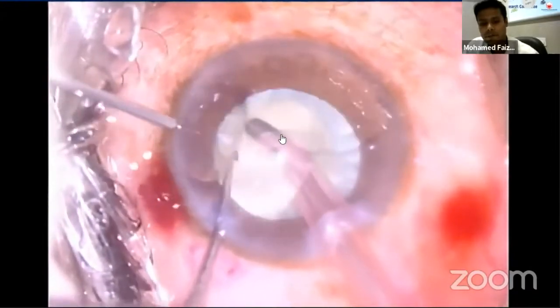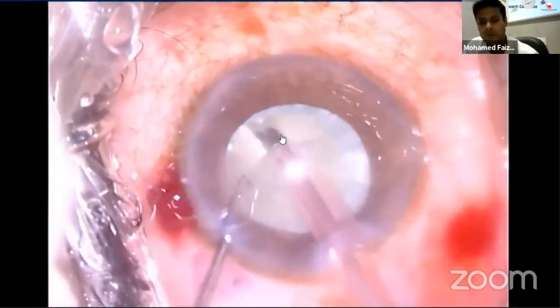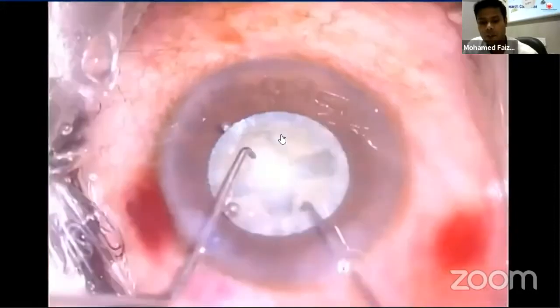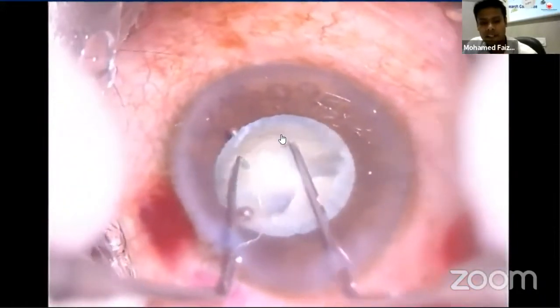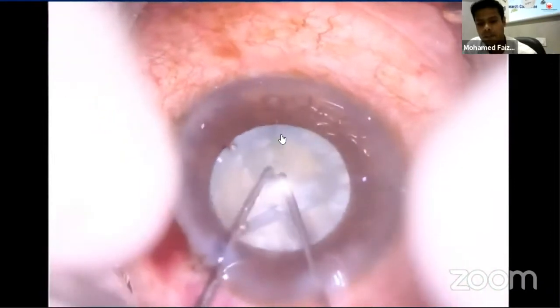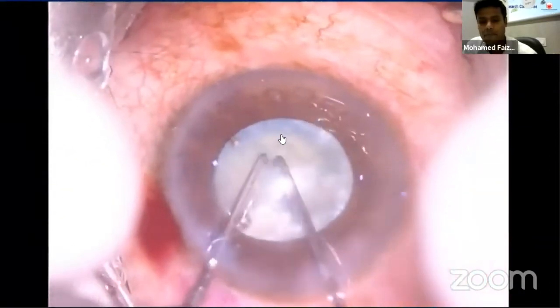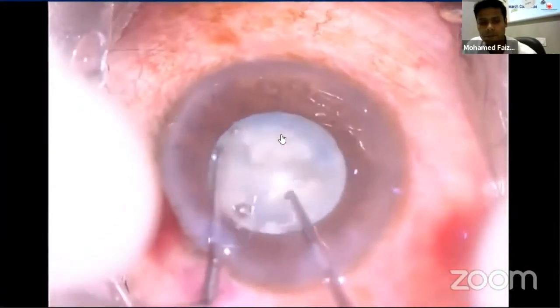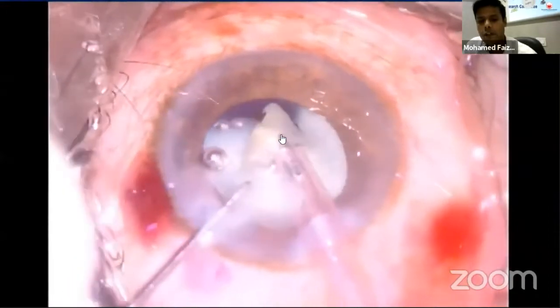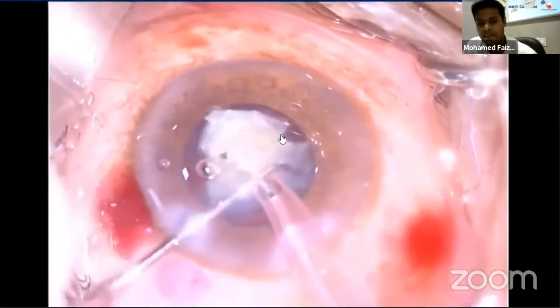Once a pair of cross grooves are created on the nucleus, the next step is cracking. Cracking can be done either by two choppers or with a chopper and FACO tip. Here I am doing conventional cracking — both instruments are placed deep in the groove and the quadrants are separated with an outward and slightly upward motion. Make sure the posterior plate is cracked; if the crack is incomplete, the instruments can be moved towards the unsplit area and the maneuver repeated. For quadrant removal, aspiration rate and vacuum are increased to better draw each quadrant into the tip, then it is emulsified and aspirated.